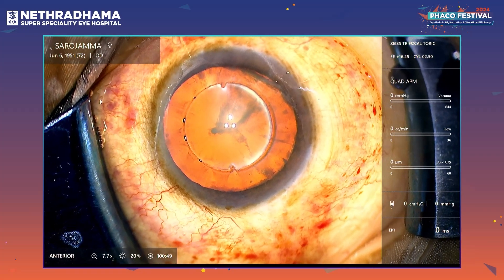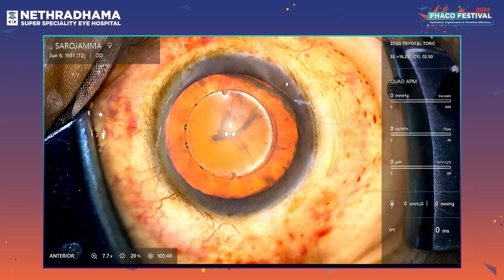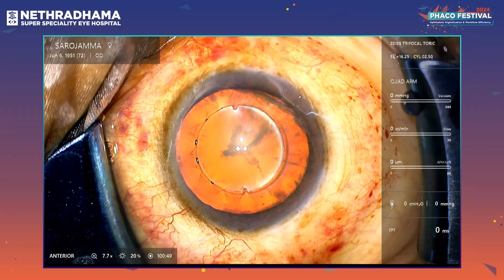I am using the Quatera 700 machine. This is a 72-year-old female with a grade 2 cataract.